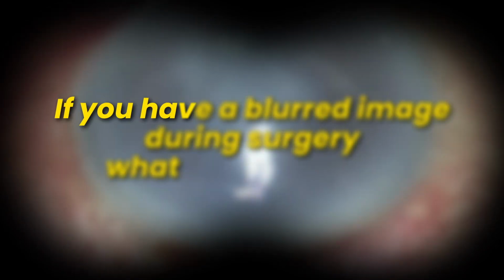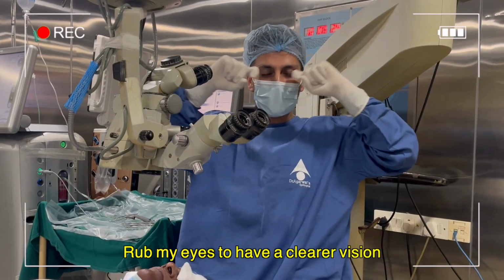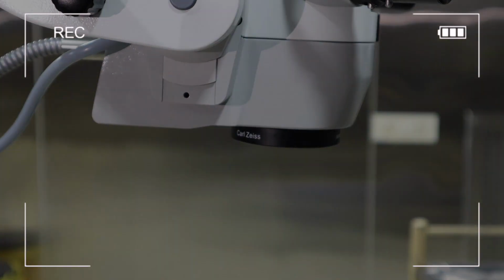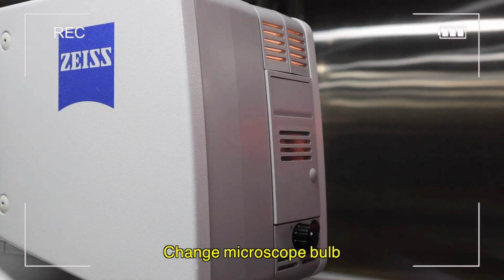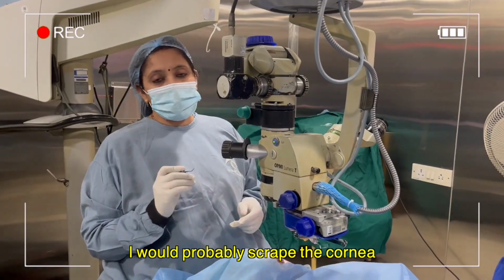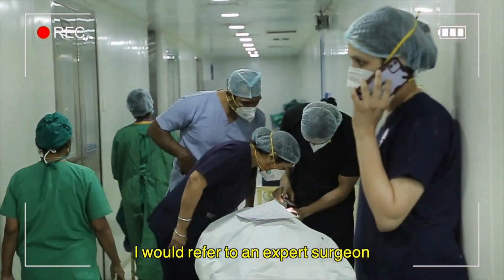If you have a blurred image during surgery, what would you do? Rub my eyes to have a clearer vision. I will ask my assistant to probably clean the microscope lenses. Change the microscope bulb. I would dim the OR lights. I would probably scrape the cornea. I would refer to an expert surgeon.